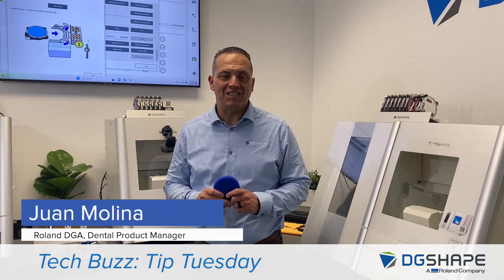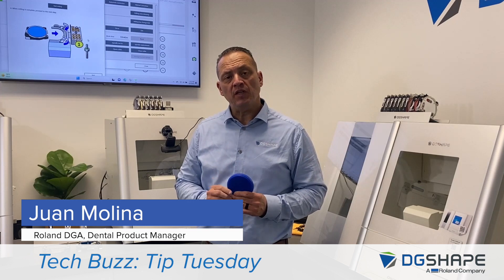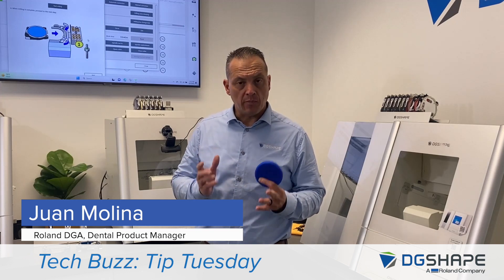Hi, I'm Juan Molina, DG Shape Dental Product Manager. Today we're going to be discussing a new feature added to vPanel — the manual correction.